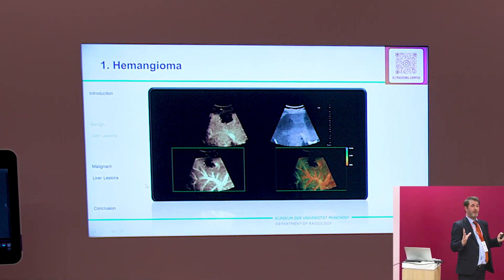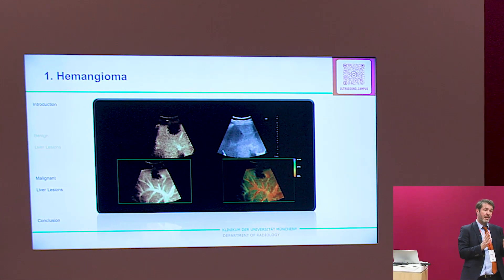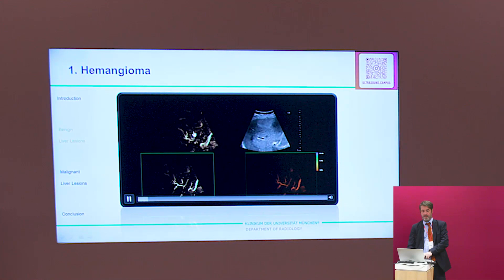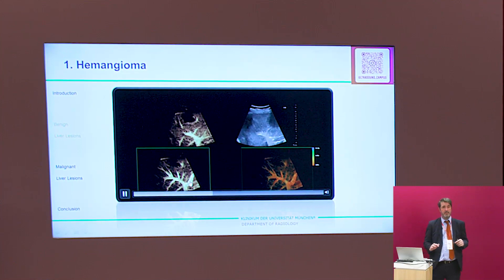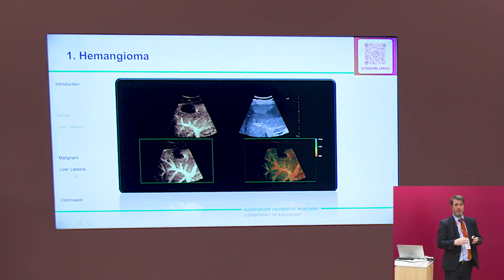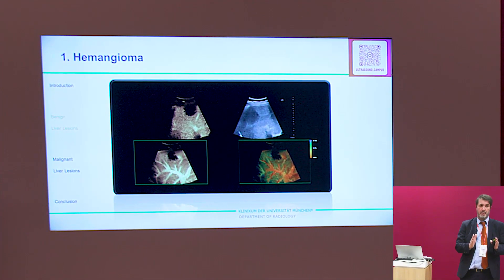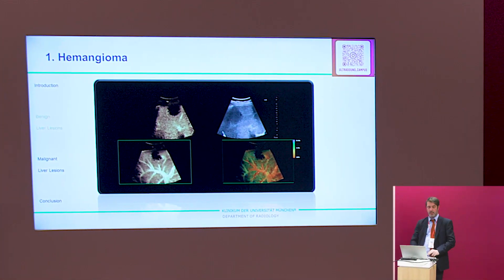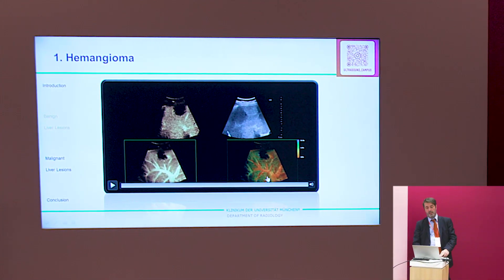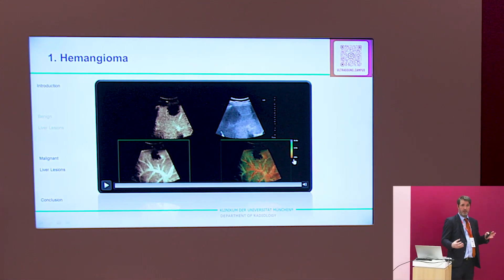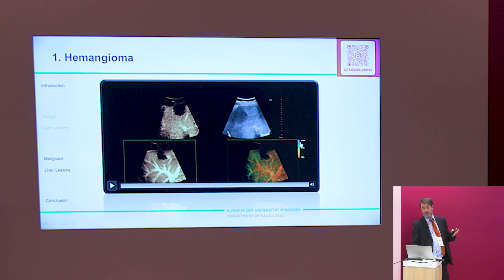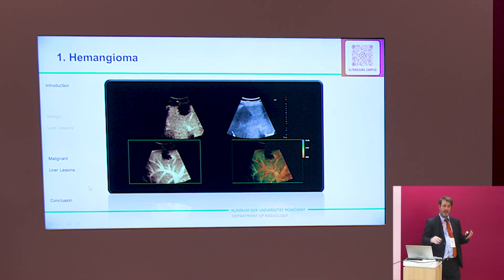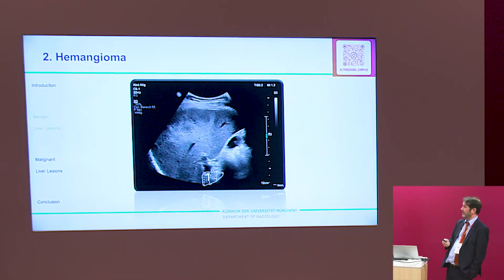An advanced technique can summarize the entire examination time into a very short clip and give you the best overview. This clip summarizes the complete examination with less artifacts. Notice the motion: the system is clever enough to keep the image stable using motion compensation mode, improving your diagnostic confidence. Here you also see the time-of-arrival map: red means early uptake, yellow means slightly later, blue means very late. You can clearly see the perimodular enhancement with early peripheral arrival — it looks like a hemangioma, and it was a hemangioma.